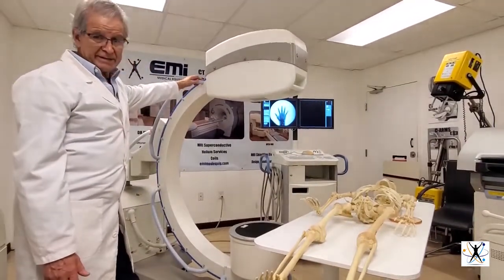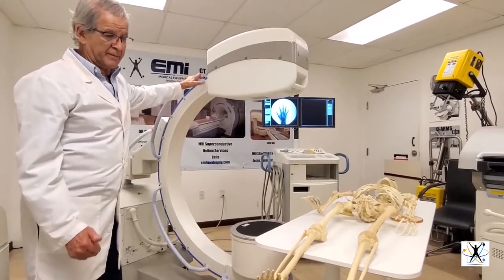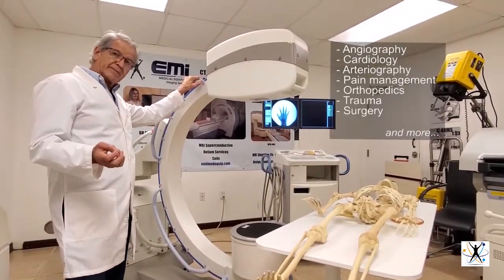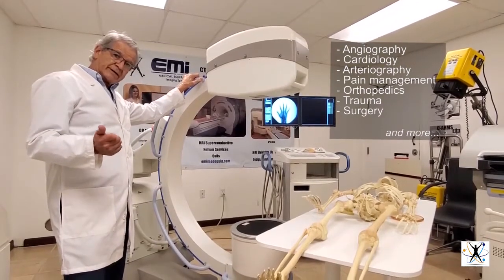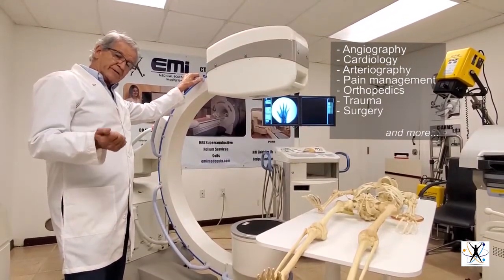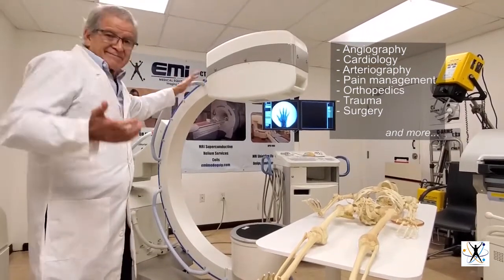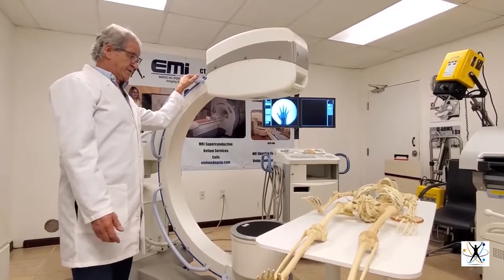This machine is good for studies in angiography, cardiology, arteriography, pain management, orthopedics, trauma and surgery — so many uses.